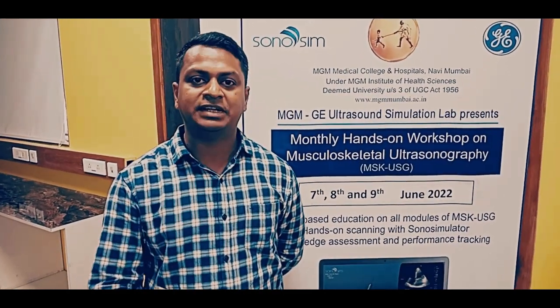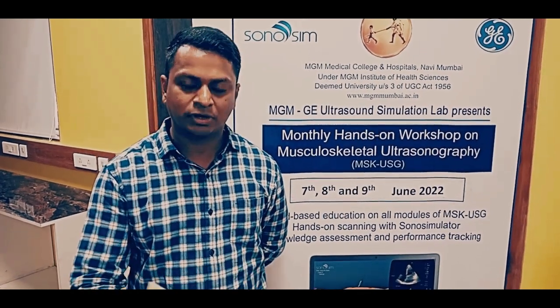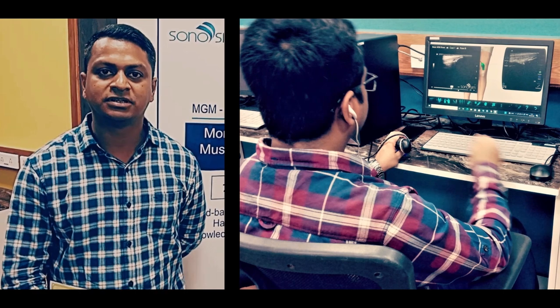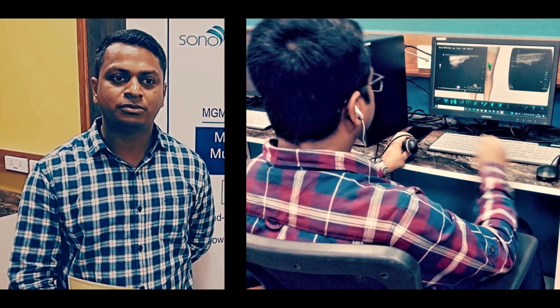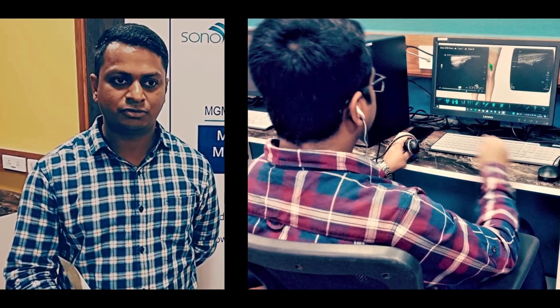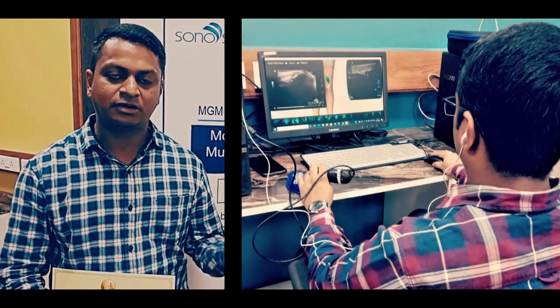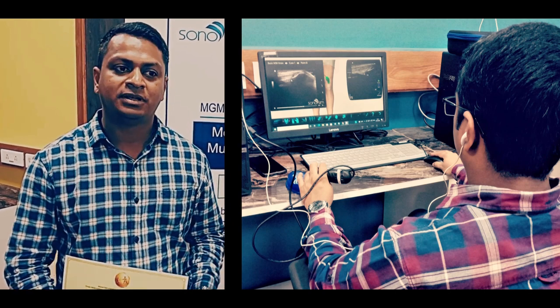After the 15 days of intensive online training, we had to come here offline. These three days we have been doing offline training. We have been getting orientation to the probe — there is a machine attached to the computer, and the probe is attached to the computer — so we are getting good hands-on training on the probe. Good practice.